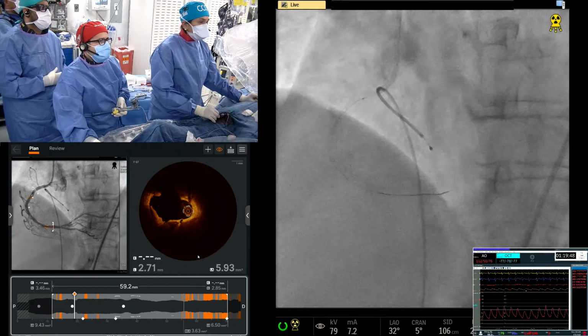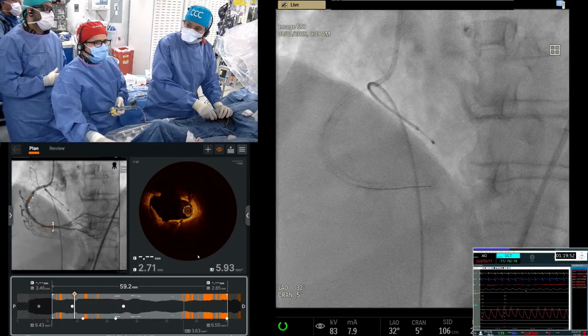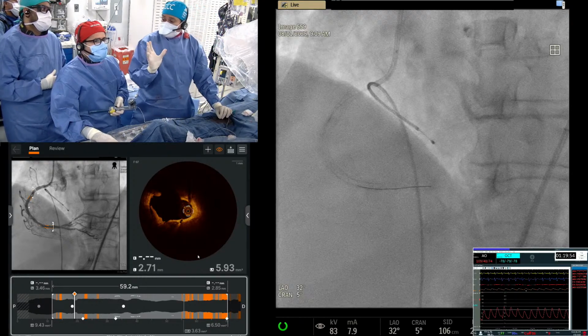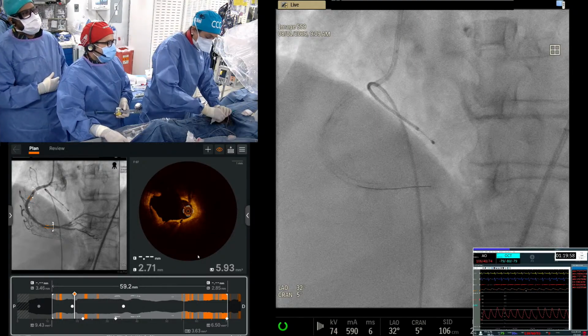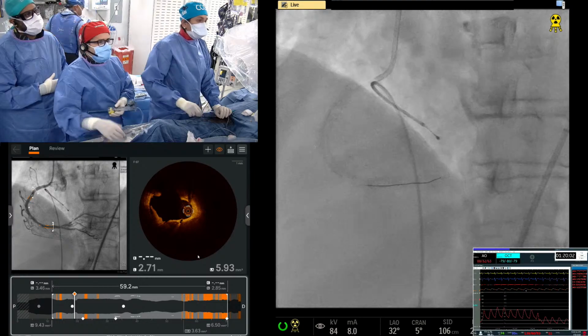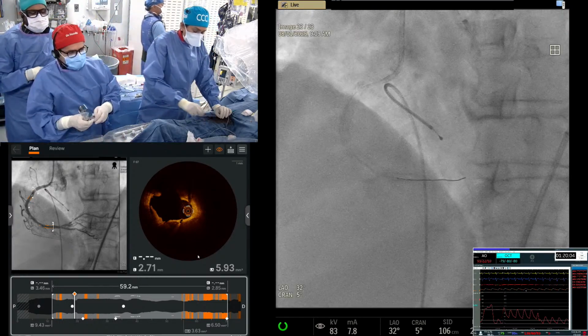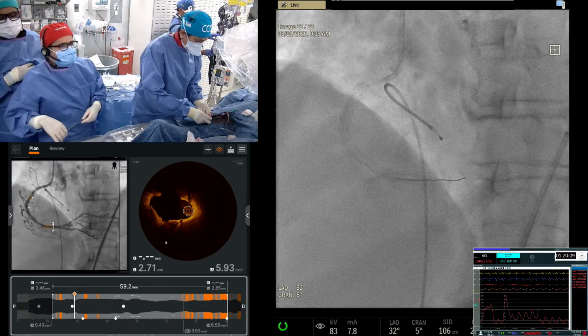But if you are imaging, the arc of the dissection criteria, it has to be the length and the arc of the dissection. Based on that, you have to decide. Yeah, nothing wrong, at any time, do a balloon and see how it looks. Yeah, you can always start with that for sure.